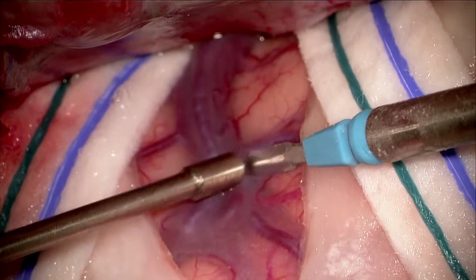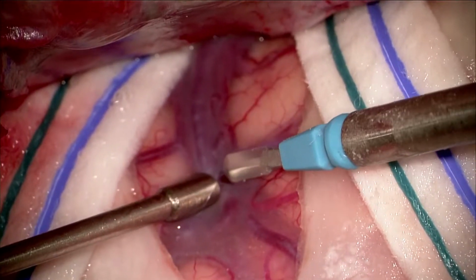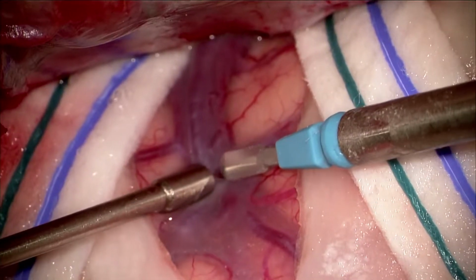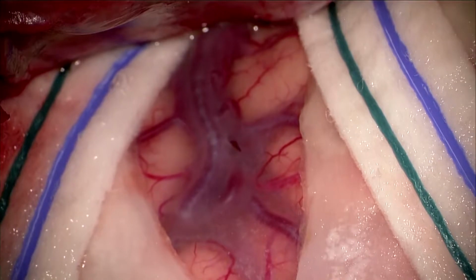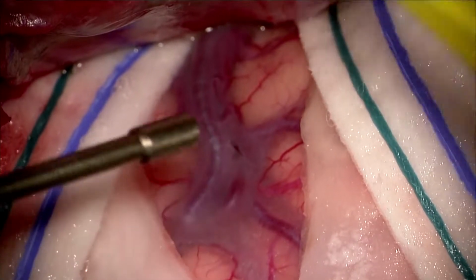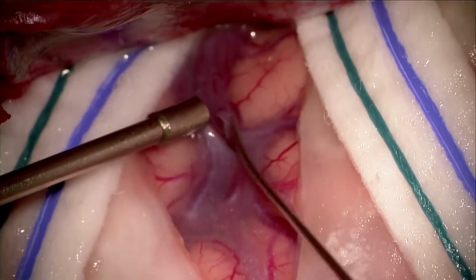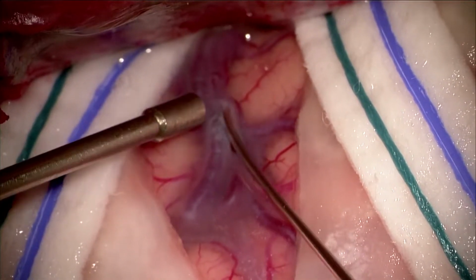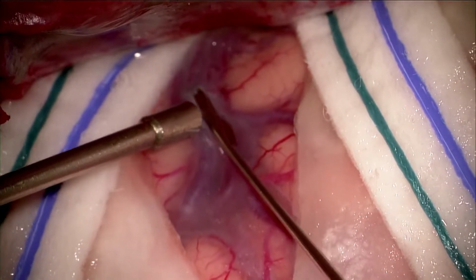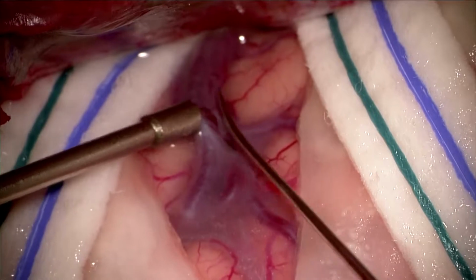So after the craniotomy has been performed and the covering, or the dura, over the brain has been opened, this is the initial view under the microscope that we get of the sylvian fissure, which is the fissure that separates the frontal and temporal lobes. On the right side of the screen is the patient's left frontal lobe, and on the left side is the left temporal lobe. Currently, I'm working to open the sylvian fissure.